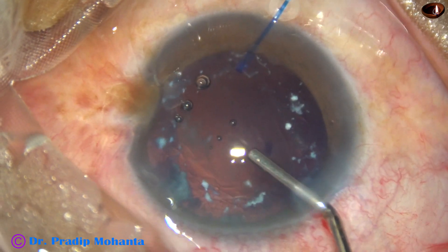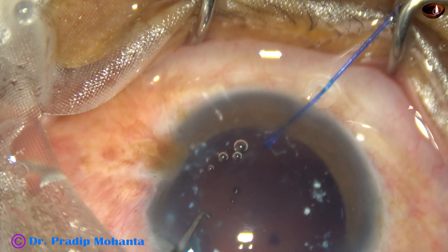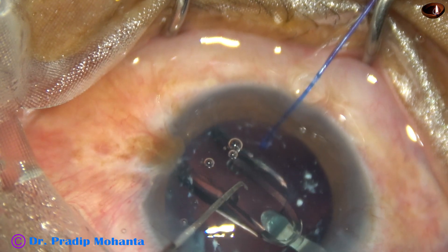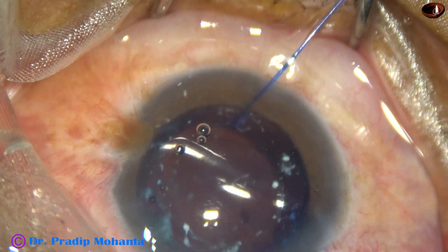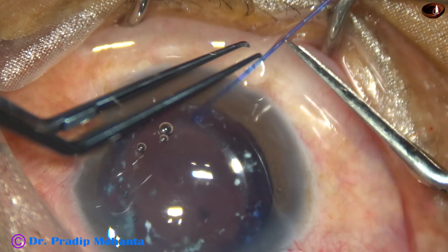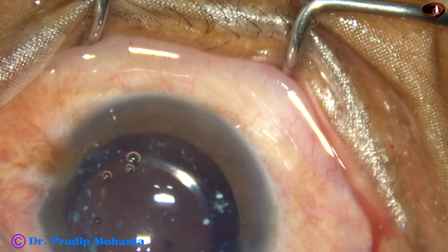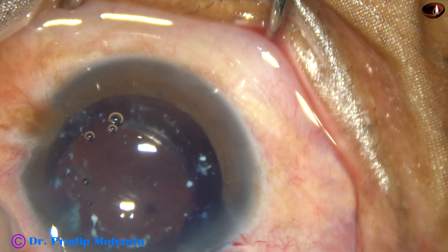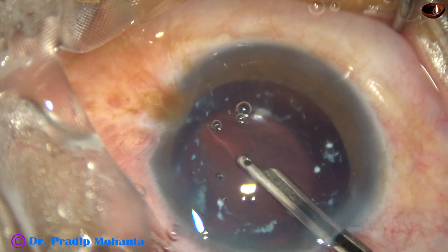I apply 2% HPMC and then implant the lens. This is a hydrophobic acrylic single-piece monofocal intraocular lens, and it has gone into the capsular bag. Before aspirating the viscoelastic, I am removing the iris hook — it has done its job. I use Simcoe for removing the viscoelastic from the anterior chamber as well as from the capsular bag.